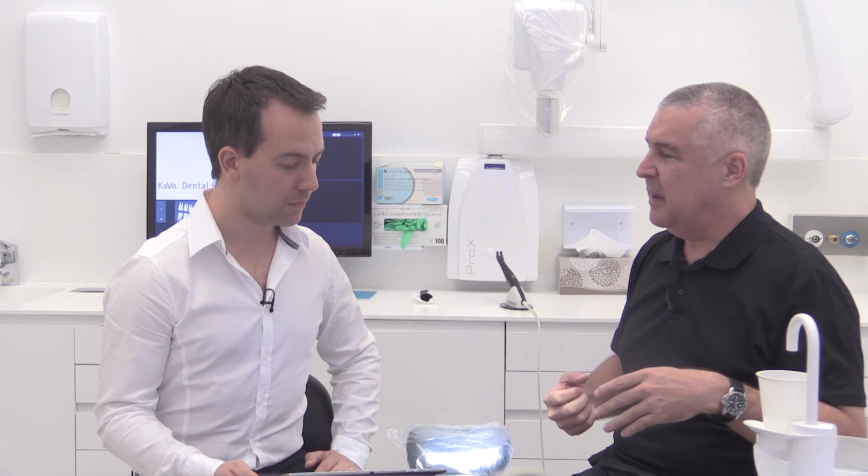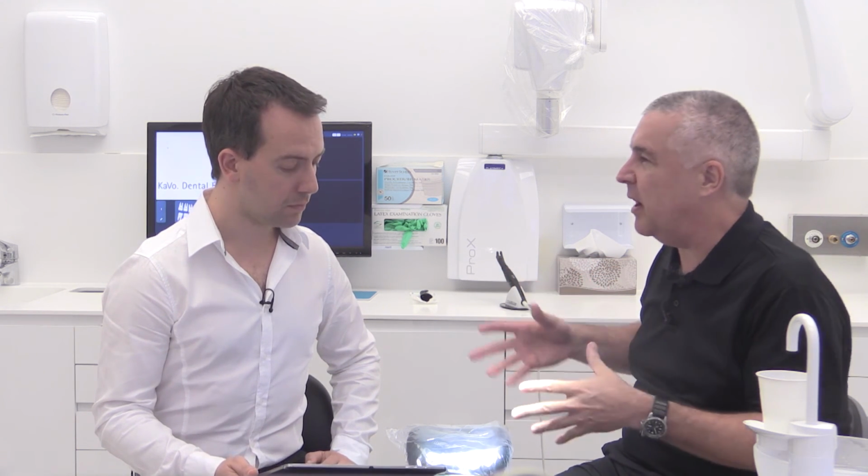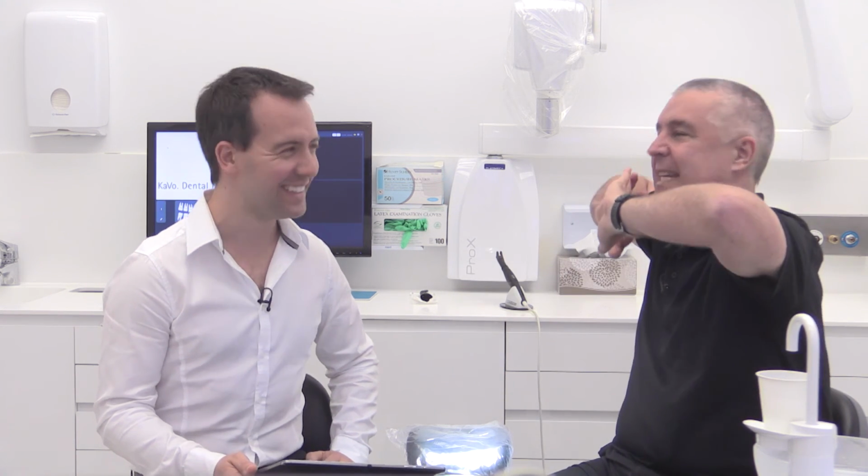But I agree that some patients have an X-ray phobia, and it's best if we talk about background radiation so they understand there is background radiation, and what we do to them is simply a multiplier of that. And I think most people can be brought around to a reasonable view. But I've got patients, I'm sure you do, who are just completely anti all that stuff. Yes, I relate. I tend to tell them that, like anything, this doesn't replace X-ray films. X-ray films don't replace this, but it does give us information that previously we just haven't had available to us.